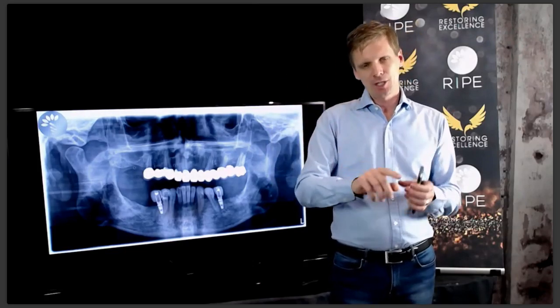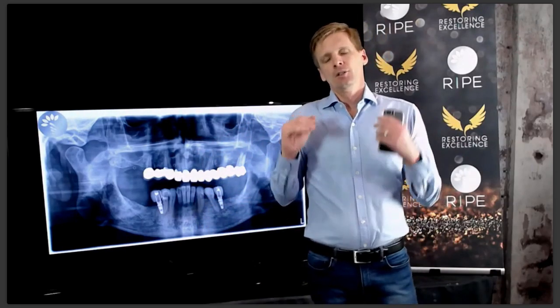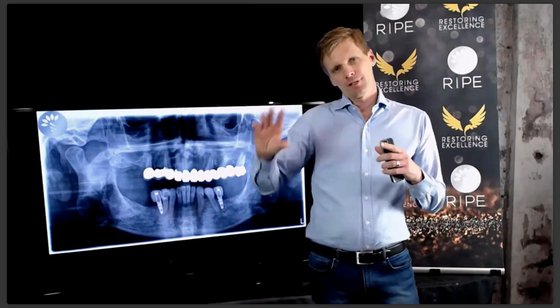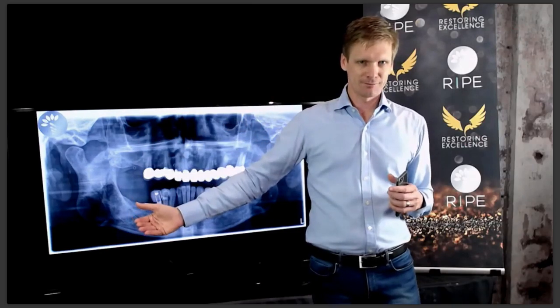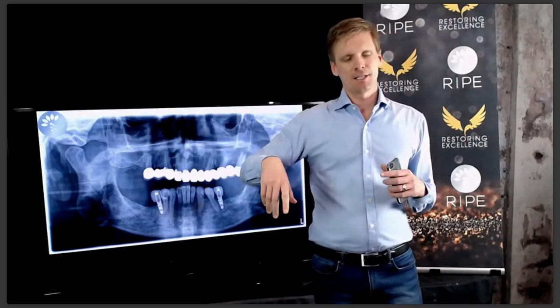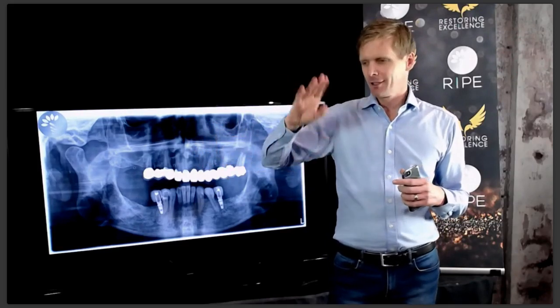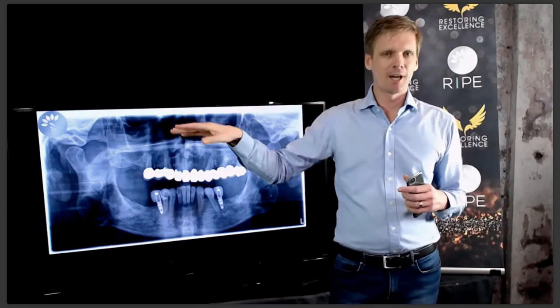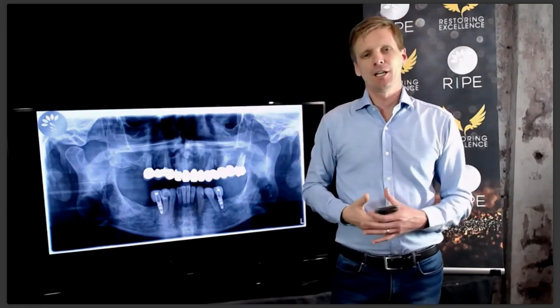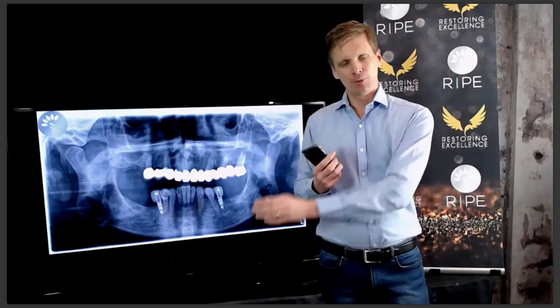if you get a TENS machine and you use one of those electromyography machines, you can show that the TENS reduces the muscle activities of all the muscles, but what you can't show is that it has any clinical significance. Okay, you can show that it reduces the little lines on your K7 or your K9, whatever it is, okay? I have one of them in the cupboard too, you can have it. It shows the muscle activity on your electromyography readouts is decreasing when you TENS someone for ages and you get them in this downward forward position, but there's no correlation between that and improved clinical outcomes.